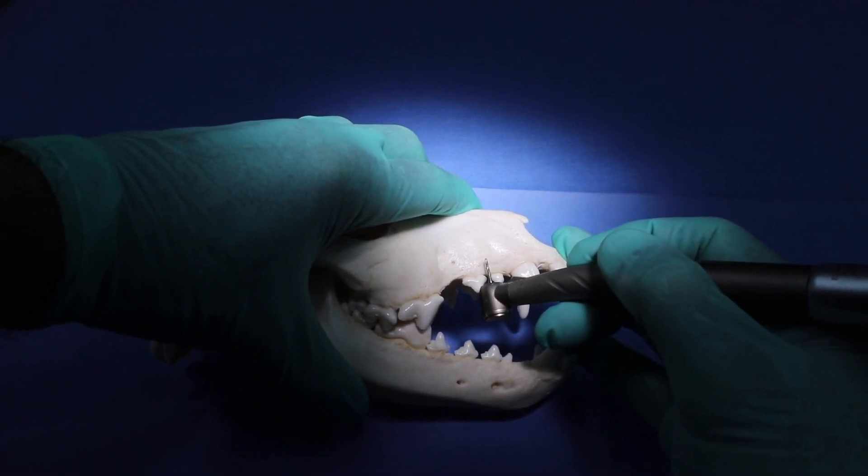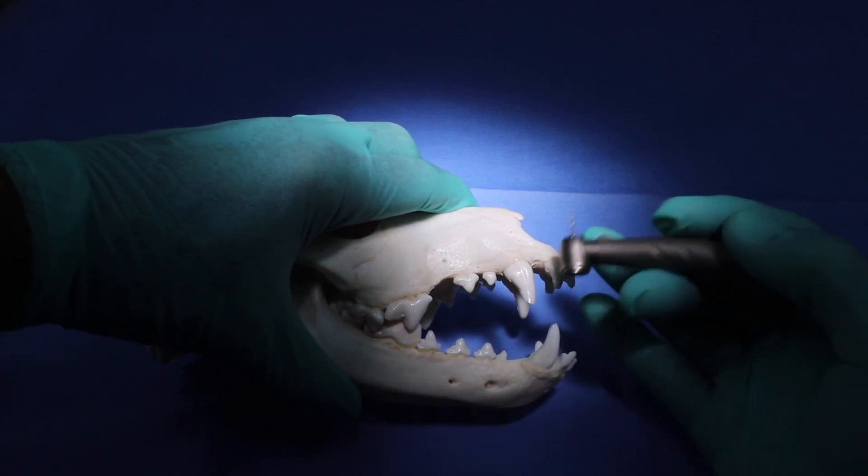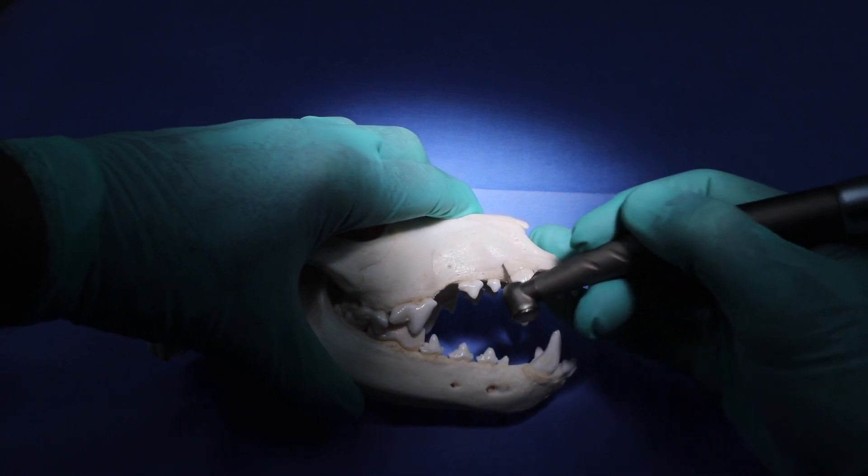And the same thing in the maxilla here — use your two fingers that are free to stabilize, and you can move around very easily removing bone and sectioning teeth.